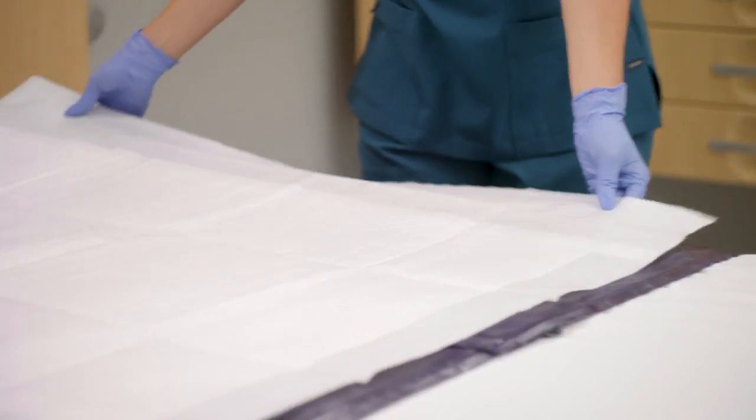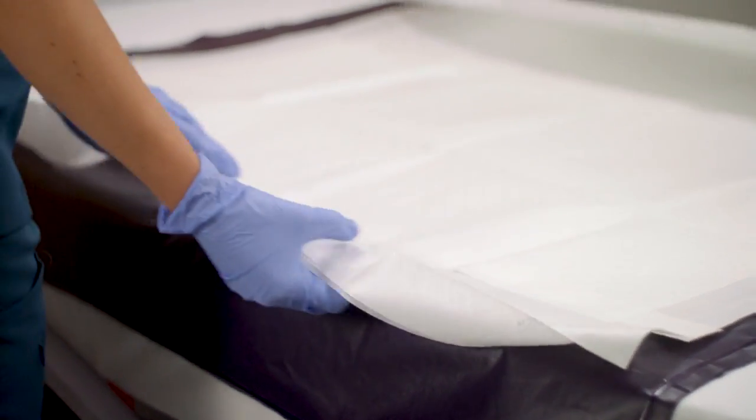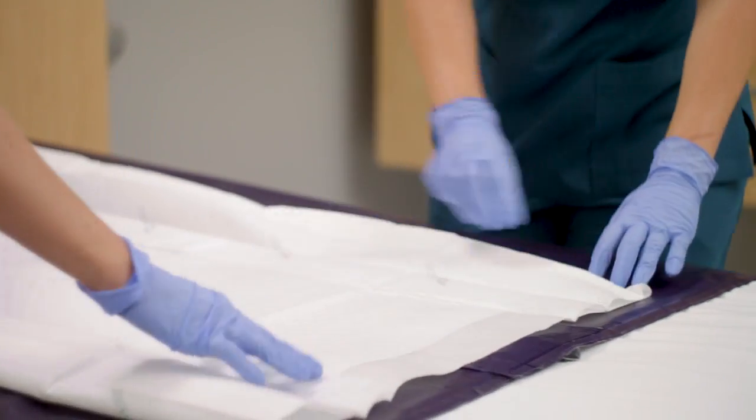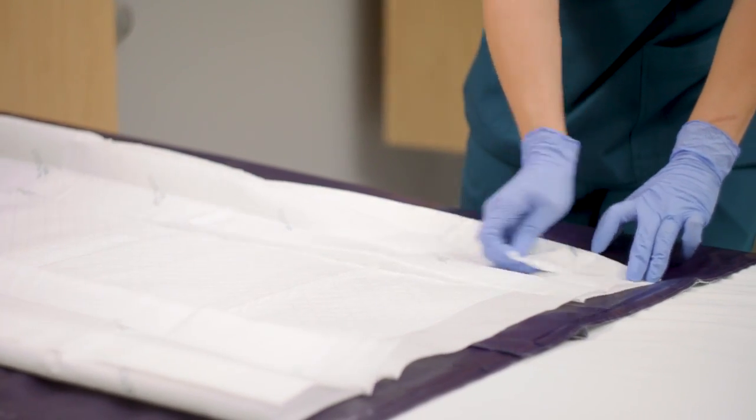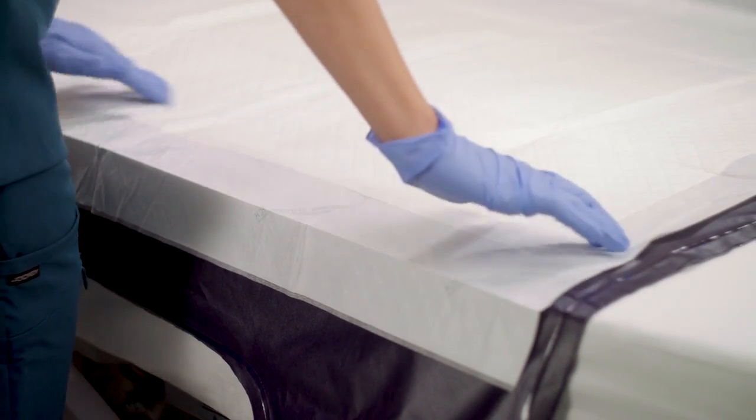The Q2R Pad may be placed on top of the device to keep the surface clean. If desired, remove the backing from the adhesive strips and secure the pad to the Q2 Roller to keep it in place. Layer linens and/or other protective pads above the device as needed.